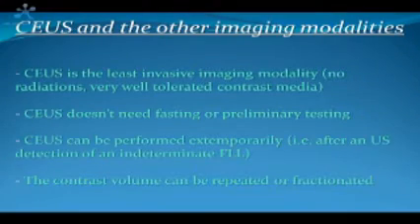So, what about the comparison between CEUS and the other more established imaging modalities of the liver? We have to stress how CEUS is less invasive from the X-ray and from the pharmacological point of view. It doesn't need fasting for the patient or any laboratory preliminary testing. So, of course, it can be performed immediately, particularly when we find, but not limited to, the case when we find an undetermined focal liver lesion at ultrasound.